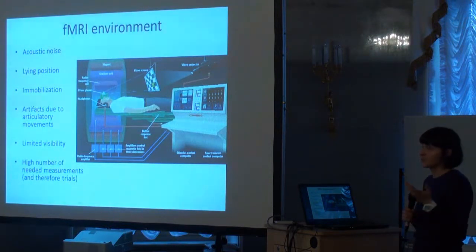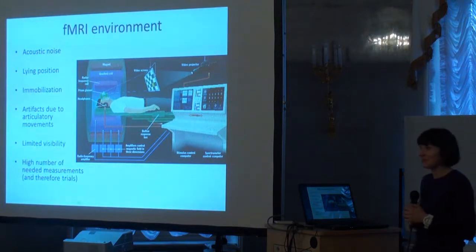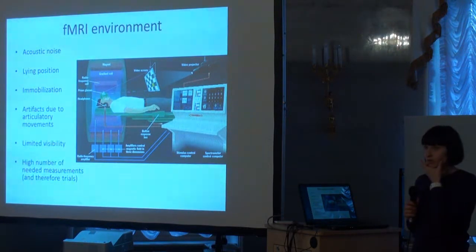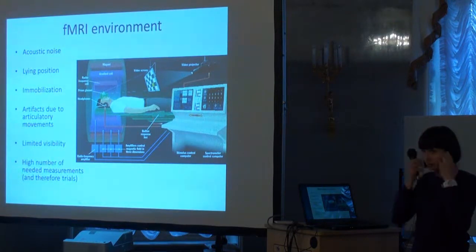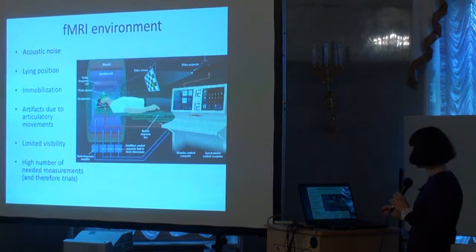And what some people do, I'm not sure if there is this kind of practice in this country, but I know they did it in Holland at some point. They used a foam to immobilize the upper part of the head, and then the jaw is free, and this part where the brain is doesn't move, which is important, and we speak with the jaw, and then it's perfectly fine. Movements are gone.